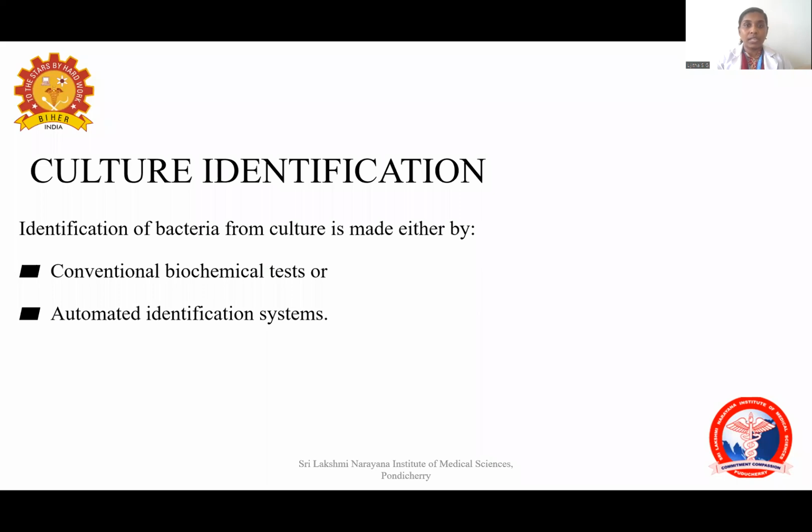And nowadays, there are automated techniques available in which the machines will give the identity of the bacteria. It is a quicker method. So recently, we are using automated methods also.